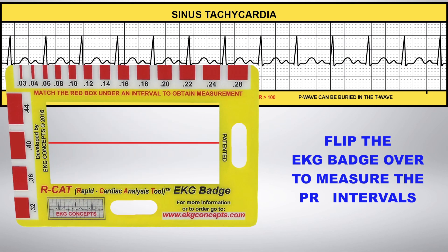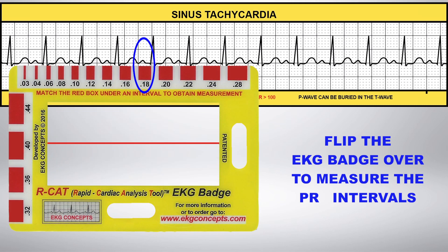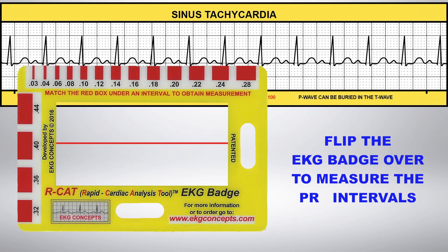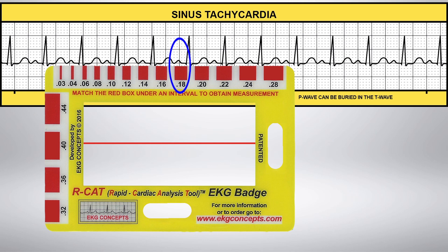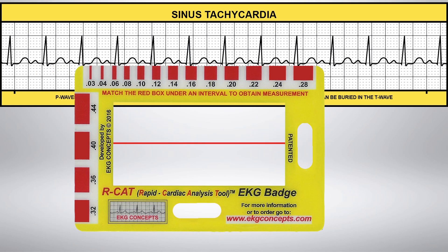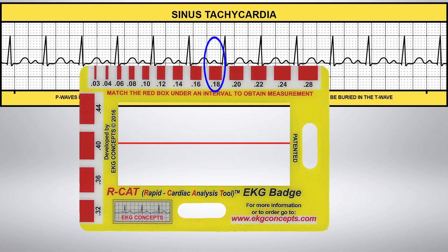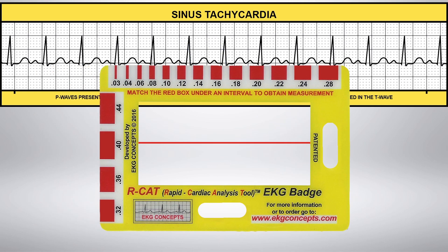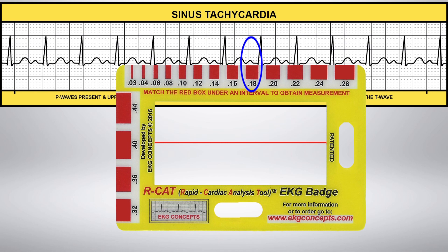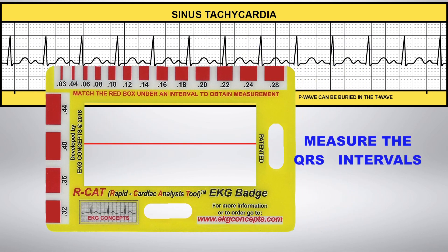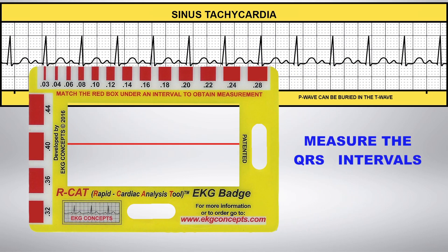Now flip the badge over to measure the PR intervals. With an elevated heart rate, the P wave can be buried in the T wave, making measurement of the PR interval difficult. In this example, the PR interval is consistently 0.18.